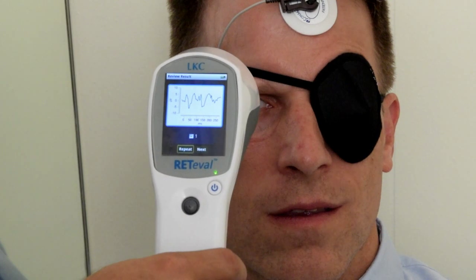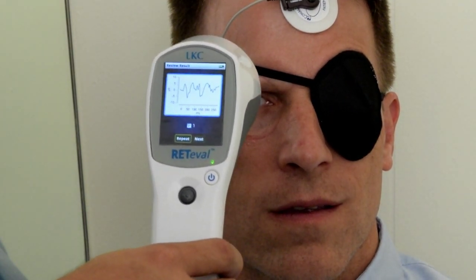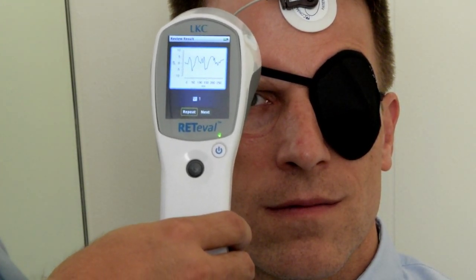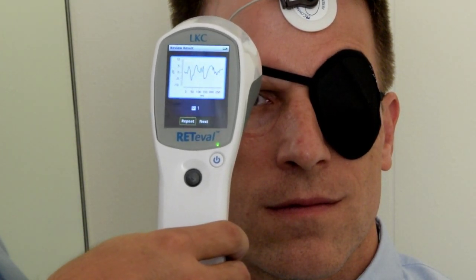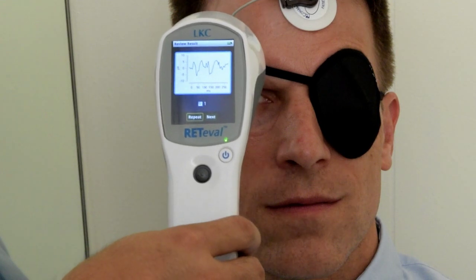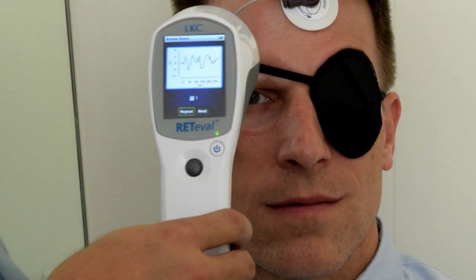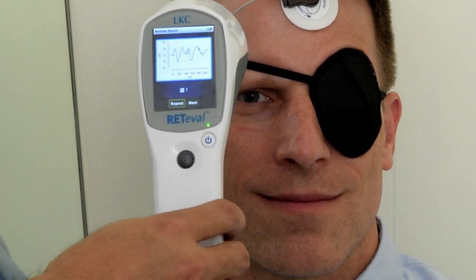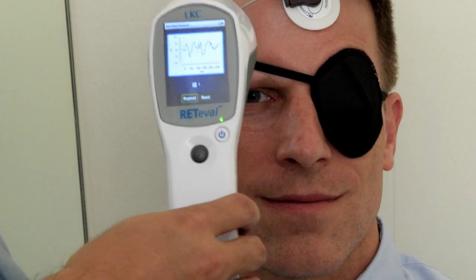Once the device has finished collecting data, it will process it and show you a picture of the waveform on the results screen. Note that this device will let you repeat the test or move to the next step. For flash VEPs, you will want to repeat a duplicate for the test. Flash VEP responses are highly variable between patients. However, the response should remain reproducible within the same patient. Therefore, you should always duplicate a flash VEP test in order to ensure the response you are getting is in fact an electrophysiological response.